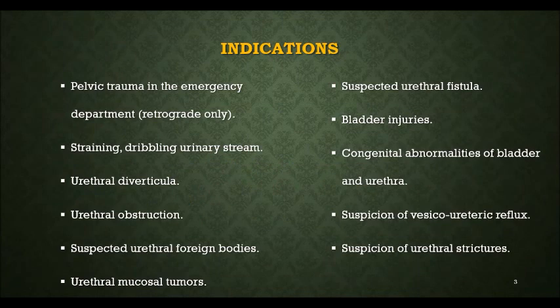We have many indications of cystourethrography. For example, we have pelvic trauma in the emergency department.